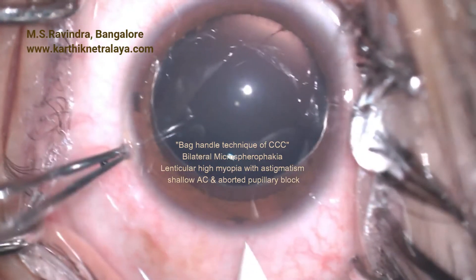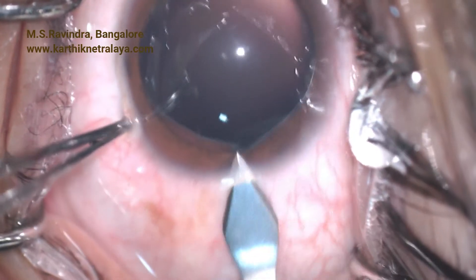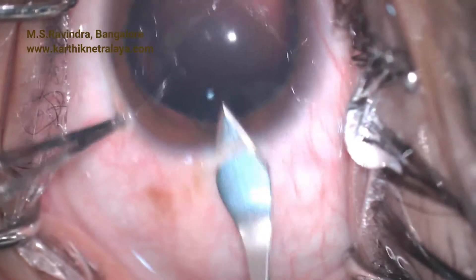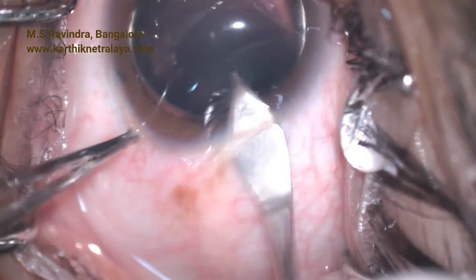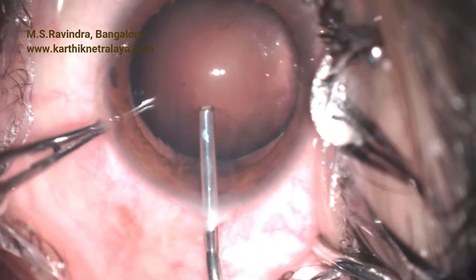Lens extraction was considered as an option for this patient with bilateral microspherophachia who presented with very high myopia, astigmatism, and recurrent attacks of high pressures due to pupillary block glaucoma.